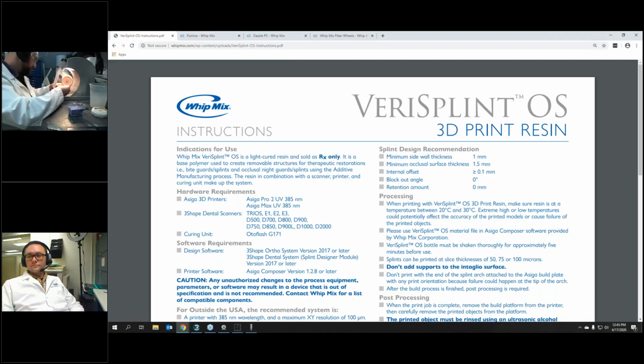All right, so just about done with the second one. We had a question from Nicola that takes us back to Wednesday: do we suggest using anti-aliasing? I'd say, and Cory can add to this, almost certainly yes. If you don't use it, you're going to get more stair-stepping along your XY contours, whereas here we just have to deal with the Z resolution contours. If you take anti-aliasing off, you're going to see more surface texturing.